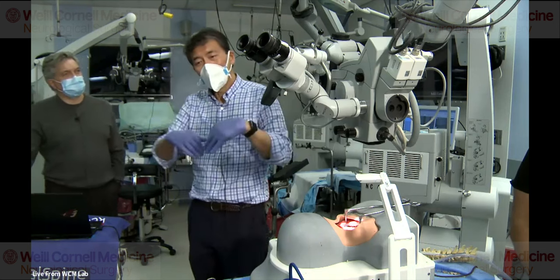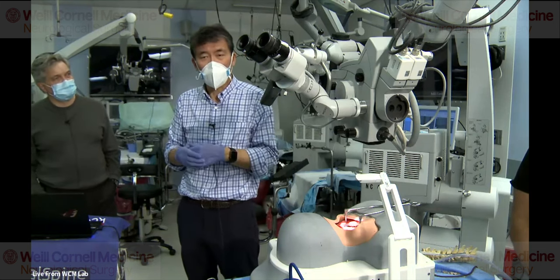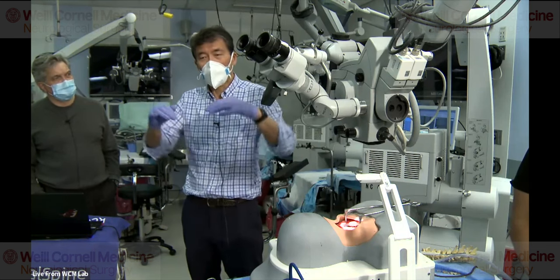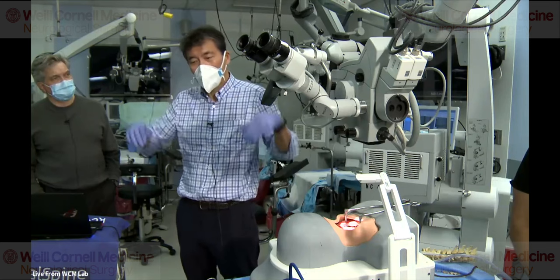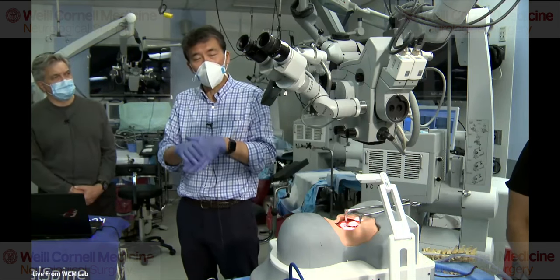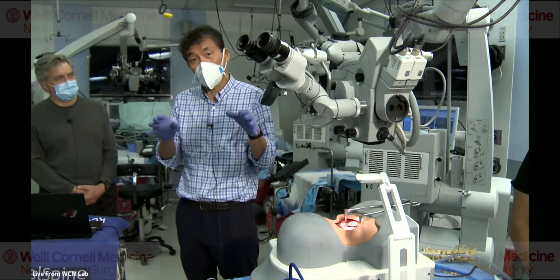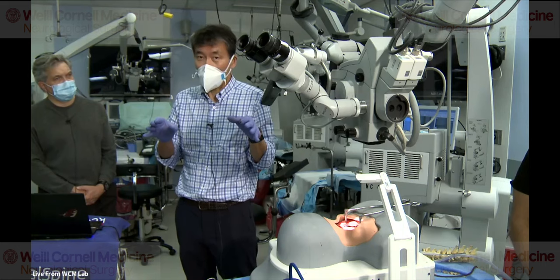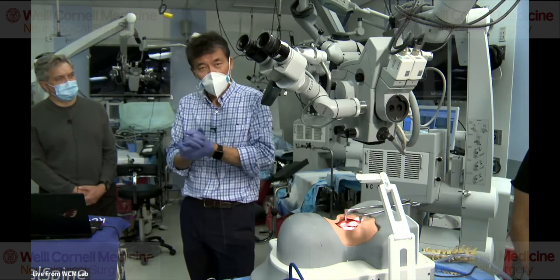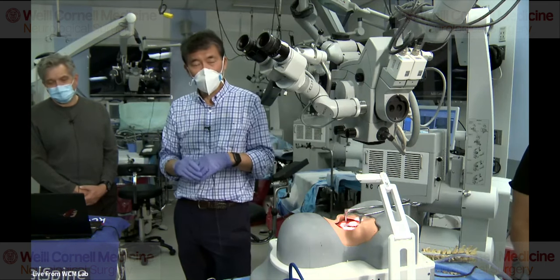Especially when you're doing an anterior, you don't want the esophagus and everything else to dry out. You want to keep it nice and moist. That's why you want to irrigate frequently, and you want to cover all of the muscle area. I tell the fellows, treat that muscle like it was a muscle in a part of your body that you would really care about, and then you wouldn't want it to dry out. And every fellow chooses a different muscle in the body. But whatever muscle you care the most about, make sure that you take care of it.